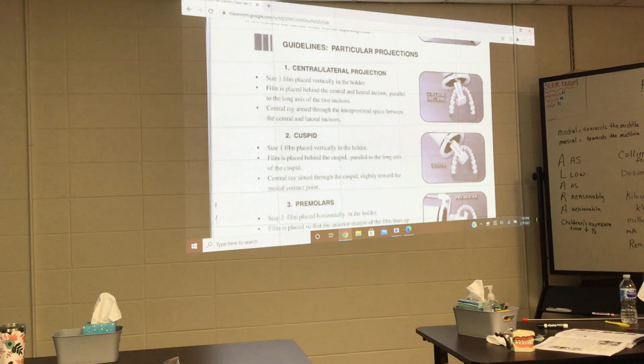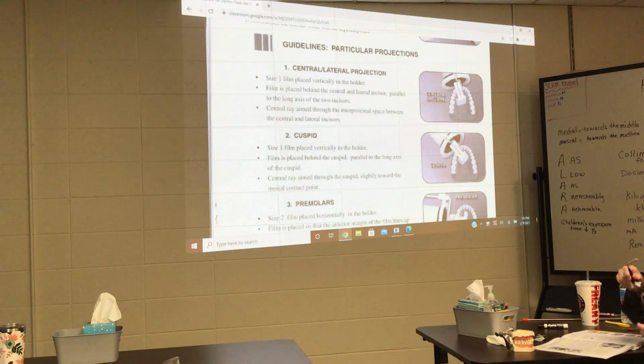I used this on a lady last time I did hygiene, when I was temping earlier in the month. And she's like, that was the easiest x-rays I've ever had taken. And all I did was give her a couple sips of water. That's it. Didn't cost anybody anything, didn't cost much time. It was all just exactly what she needed. That's a little trick you can use if you don't have salt available and would have to run to the kitchen to get it. I have water right there in my operatory. So that's why I use the water.